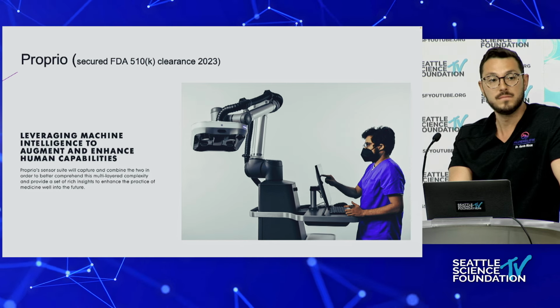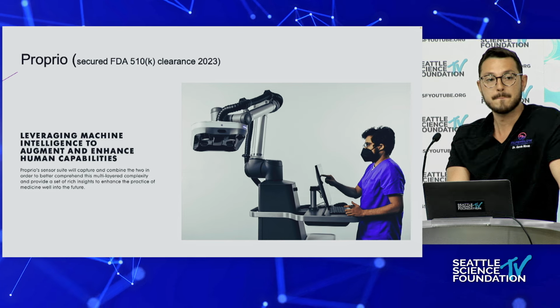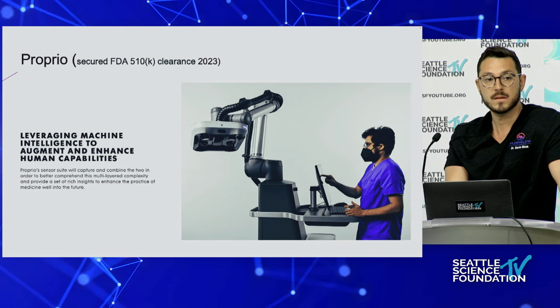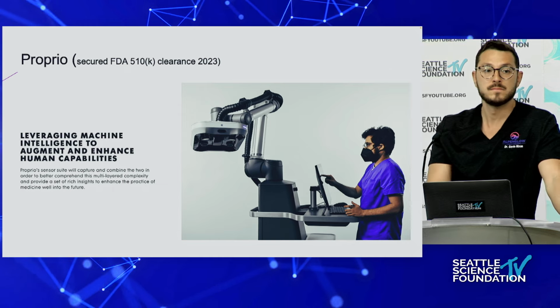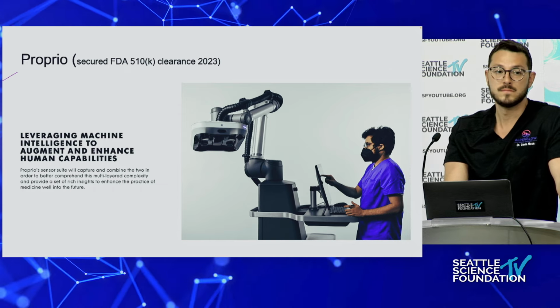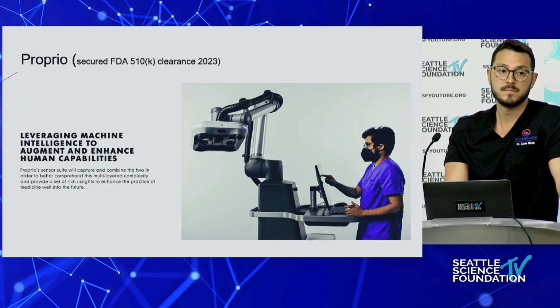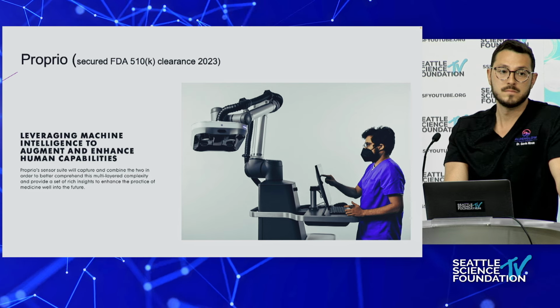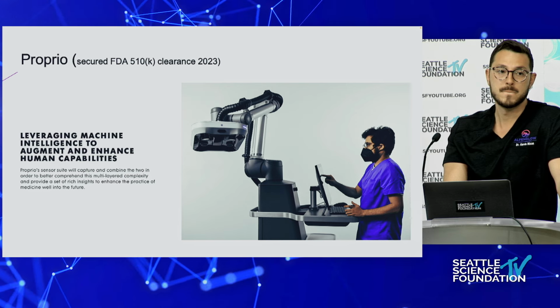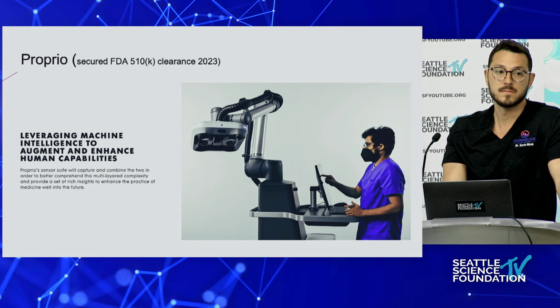Any questions? So when I first started doing kyphoplasty, I did like 50 last year, and one of the ortho surgeons in my facility said you should look into O-arm to see if there's a navigation assisted option, because over the course of your career, it's a ton of fluoro. And so meeting with my surgical services director, she was basically like, sorry, these procedures don't pay enough to justify you using the O-arm. And so that's, I think, the big hang up.